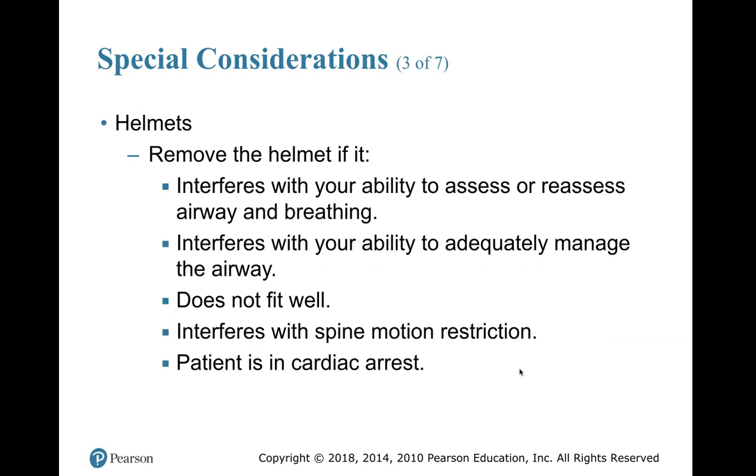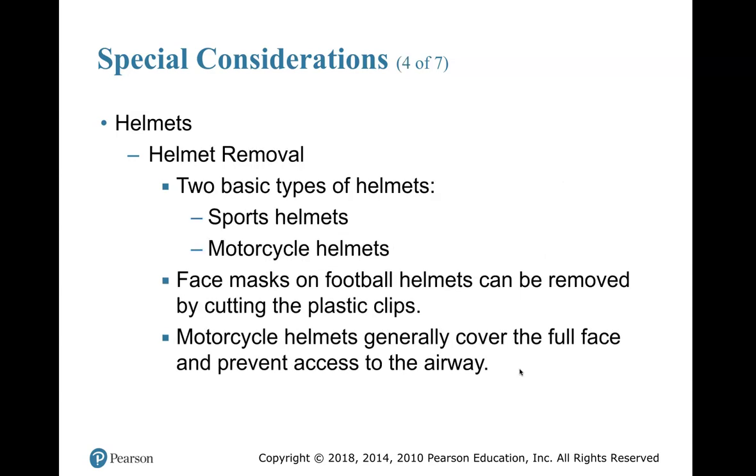All right, remove the helmet if it interferes with your ability to assess or reassess airway and breathing. If it interferes with your ability to adequately manage the airway, it does not fit well, it interferes with spine motion restriction, or the patient is in cardiac arrest. Two basic types of helmets: sports helmets and motorcycle helmets. The face mask on football helmets can be removed by cutting the plastic clips. There are helmet face mask removal tools if you want to go that far and get one. But some of the helmets are different, so you may just have to get some handy-dandy cutters to cut the clips.